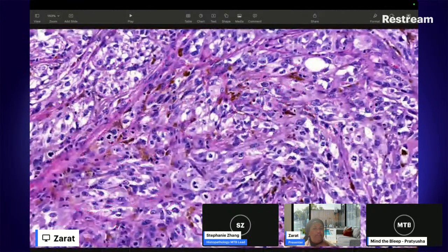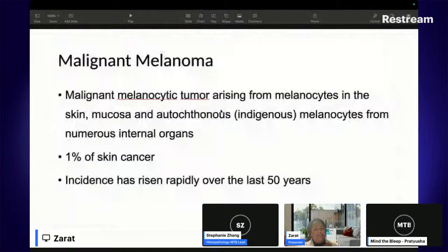So melanocytes, but just look how abnormal they look, how ugly they look. They're not uniform at all. Some of them have these large nucleoli, these darkened areas within their nuclei, mitoses, mitoses, mitoses. You can see some pigment. Again, mitosis there. It looks very, very ugly compared to the nice melanocytes we saw before. So we worked through all of that. So this is a malignant melanoma.